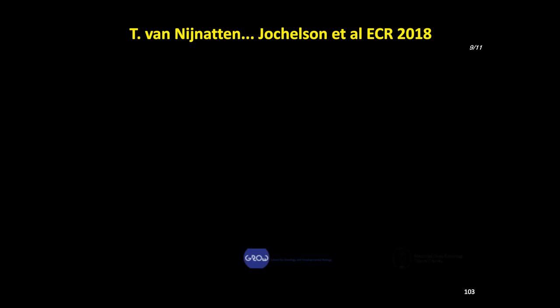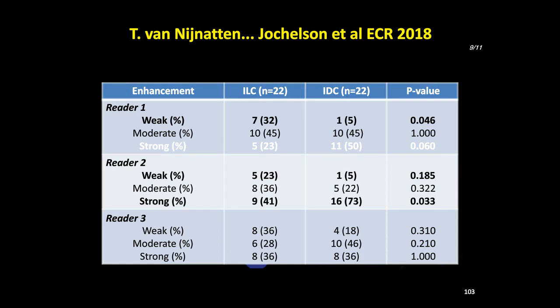We have recently completed a study, which was just presented at the European Congress of Radiology, where we looked at enhancement of invasive lobulars and compared them to invasive ductal cancers. And in fact, patients with invasive lobular cancers have less enhancement than those with invasive ductal cancer. So it is really important that even if you have a faintly enhancing lesion, that you go forward and work it up for cancer.